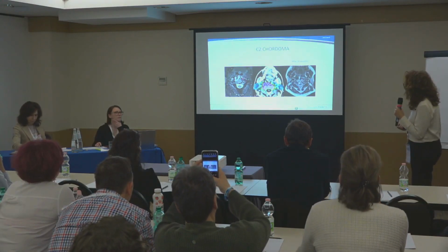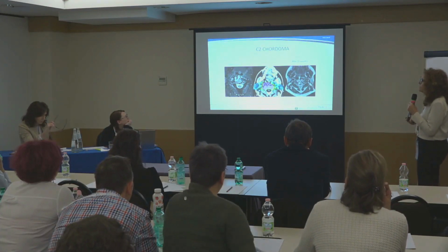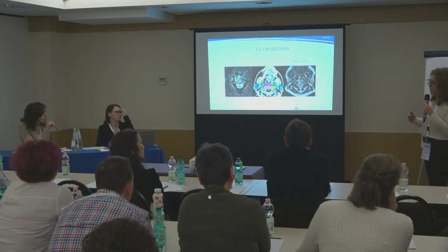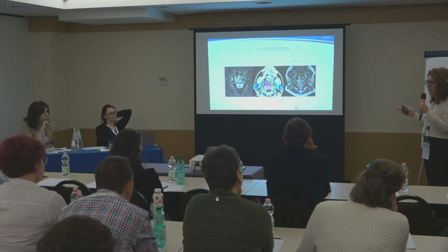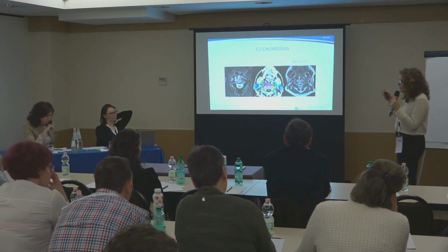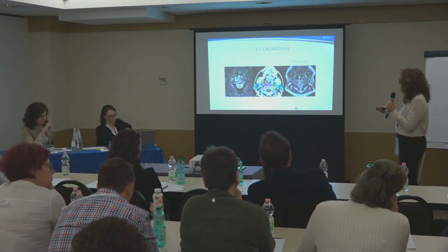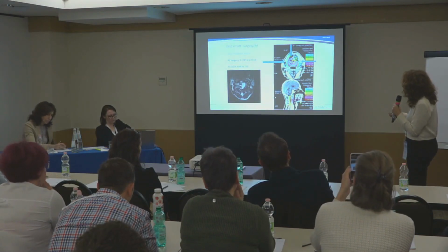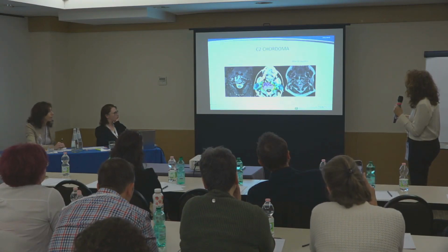Quickly, this case is a vertebral chordoma. This patient refused the surgery, and we treated with carbon ions after a long discussion with the patient, because sometimes patients want to refuse the disabling surgery, but it's our duty to explain very well which is the best choice for them. In this case, if patients refuse, we cannot say anything. So, the recurrence next to the spinal cord after 20 months.